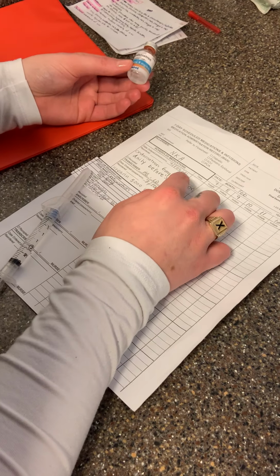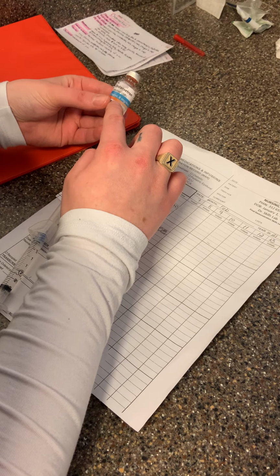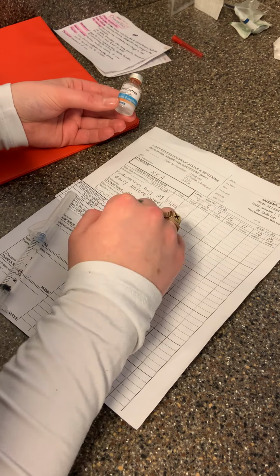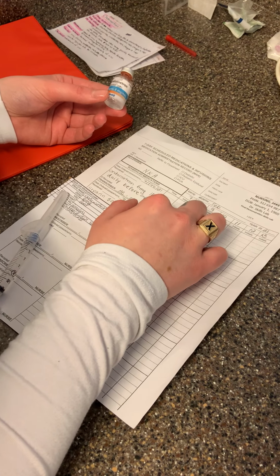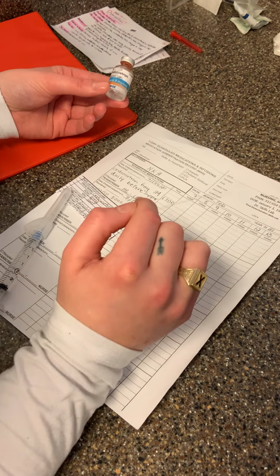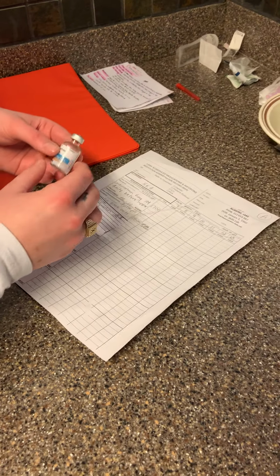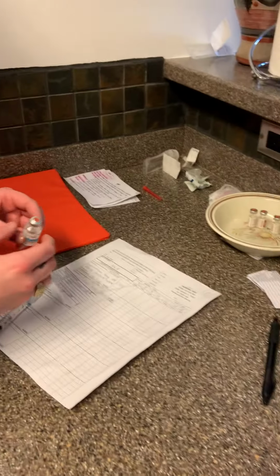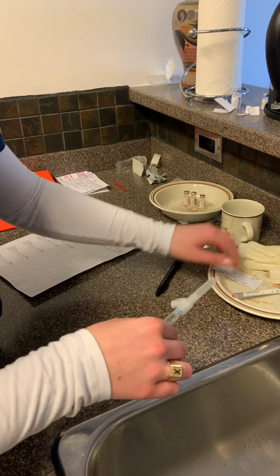It is given IM. This doesn't say IM, but we checked the drug monograph and it said it was safe to give IM. It's an IM needle. It's given daily before supper at 1700 hours. It is 16:35 right now, so we're within the half-hour time window, and no one has given it, so we will give it. This is a single-use vial, so I'll be throwing it in the med waste container. Then I will get ready to go to the bedside.